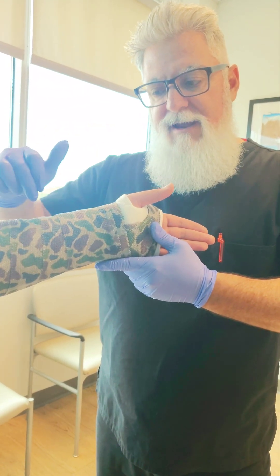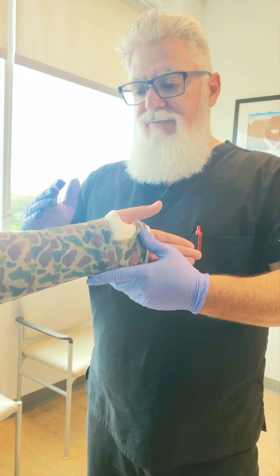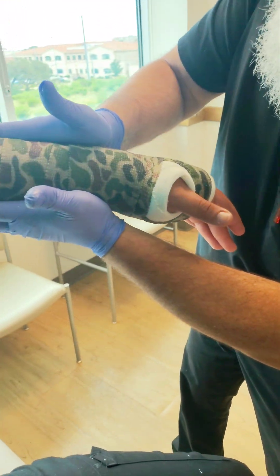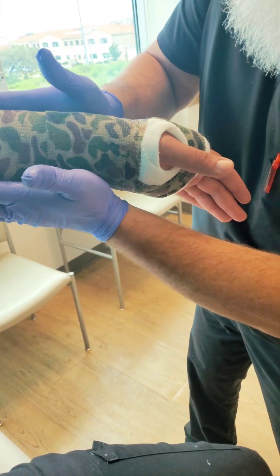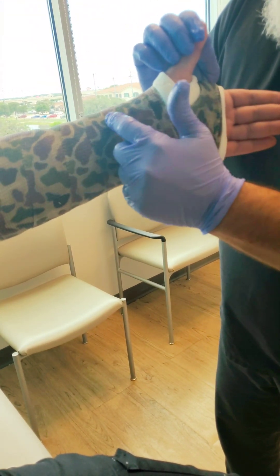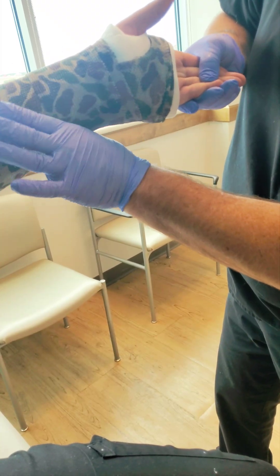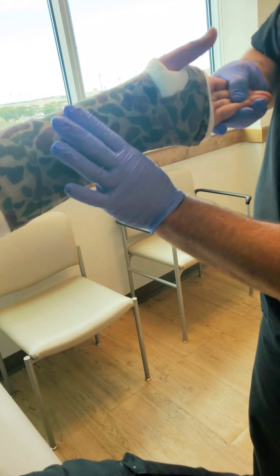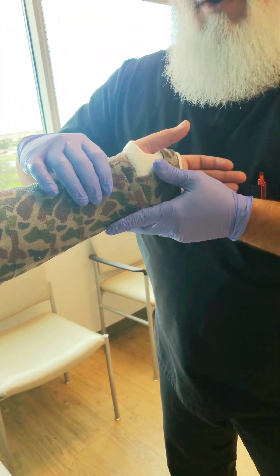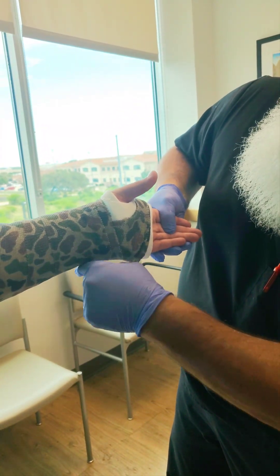This one is going to cover how to do a similar type cast but also with a volar mold. Many times when you're working with a surgeon or provider, they'll say they want an interosseous mold. Then the doc comes back and says, 'Hey, I was looking at the x-ray and I've got a little alignment issue with the radius — let's do a little volar deviation.' Or the consulting surgeon says they'd like a volar bend in there as well.